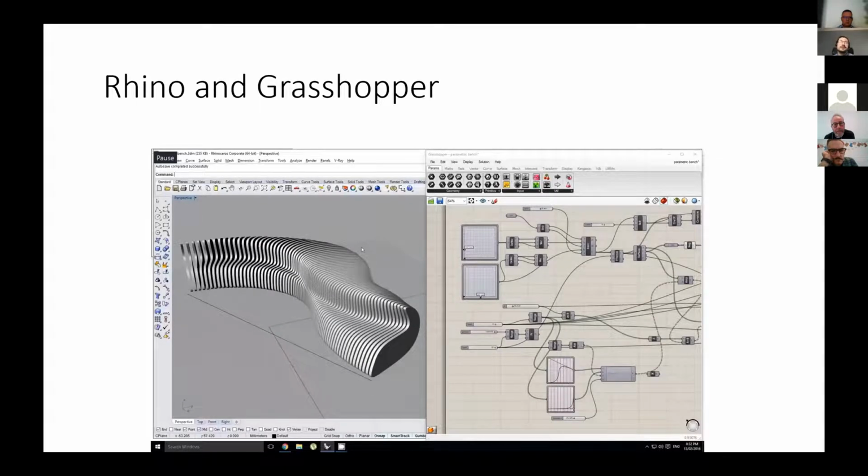All of this software has been developed in two commercial softwares, Rhinoceros 3D and Grasshopper 3D. And as you can see on this picture, Grasshopper 3D is a visual scripting plugin for Rhino, meaning that instead of writing code, you can also plug inputs and outputs into each other. And there's also a wealth of various plugins for geometry creation available online that you can buy or license, or they're open source.